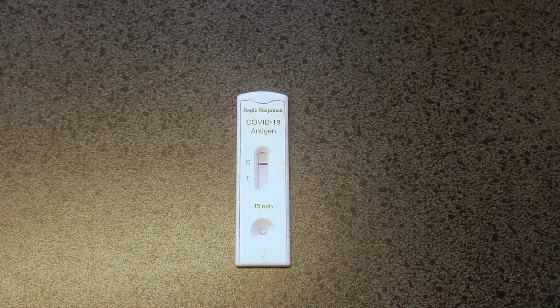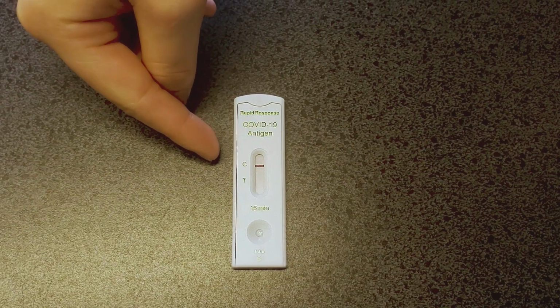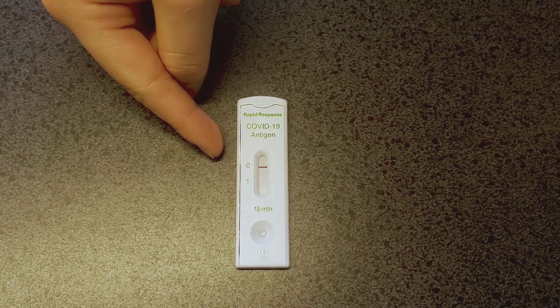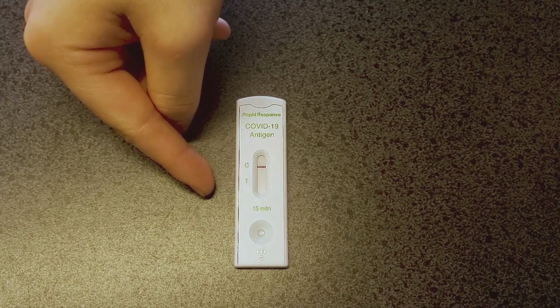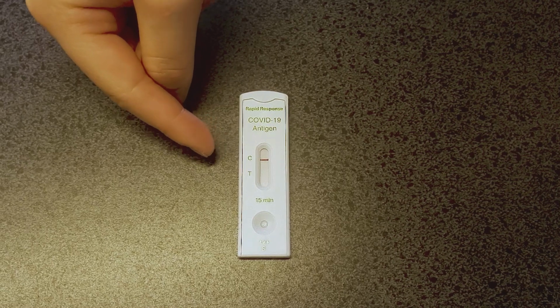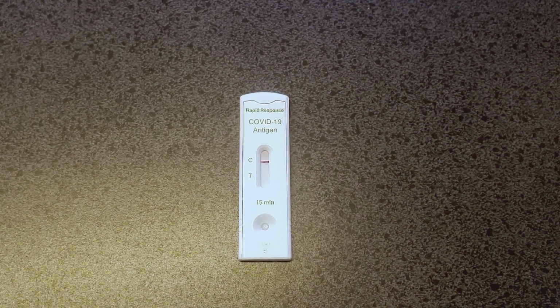To interpret the results after 15 minutes, you would see a letter C and a letter T. One line at C means that it is a negative result. When you see 2 lines, a line at C and T, that means it is a positive result. Invalid results might be where there are no lines or there is only 1 line at T, and you would need to complete a new test.